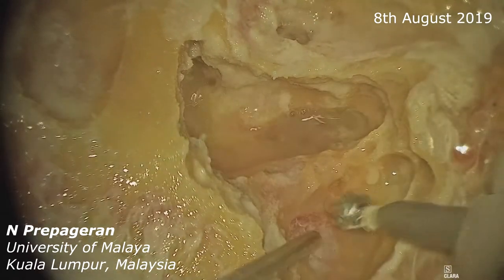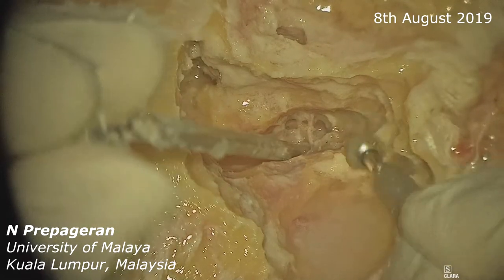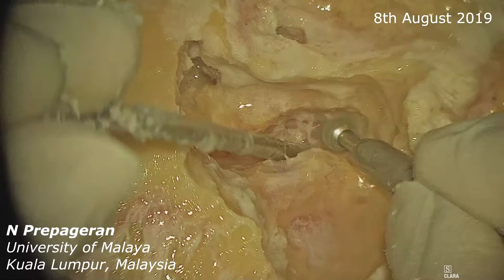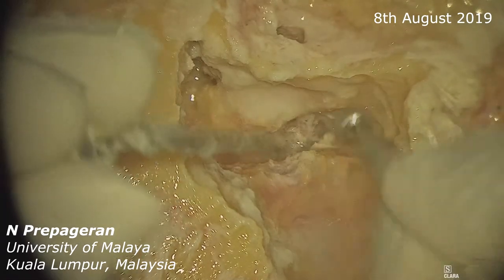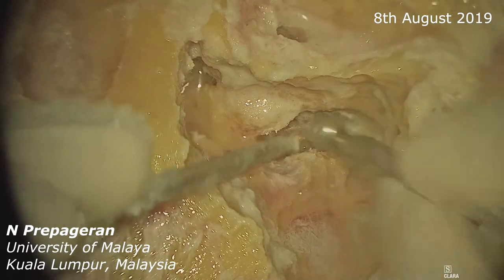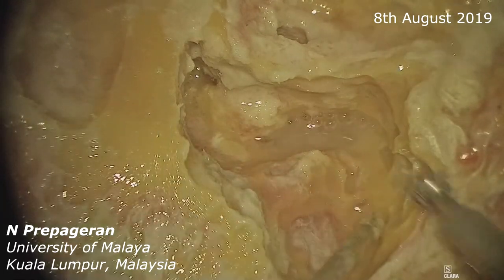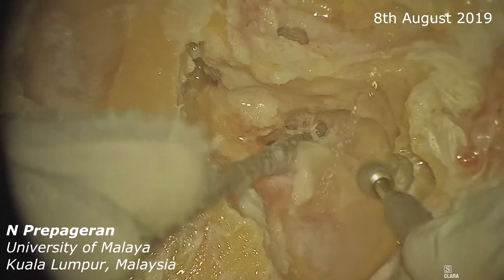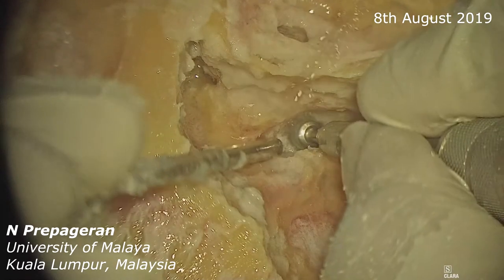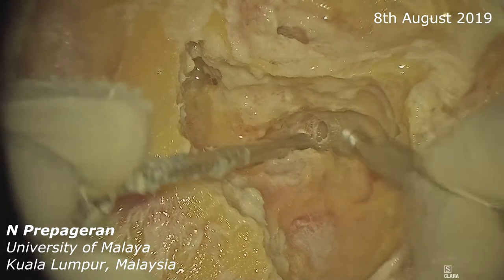So once we have this, let me now just thin back the sigmoid sinus a bit more. The sound is changing again, which means I'm very close to the sigmoid sinus. You're going to find a jugular bulb — that's the jugular bulb coming into view. When you guys do this, don't use a cutting drill — use a diamond, it'll be easier. It's much easier to destroy structures using a cutting drill. But if you want to learn tactile sensation, use a cutting drill — that's how you learn to control your drill.